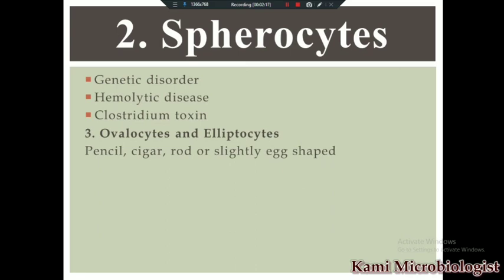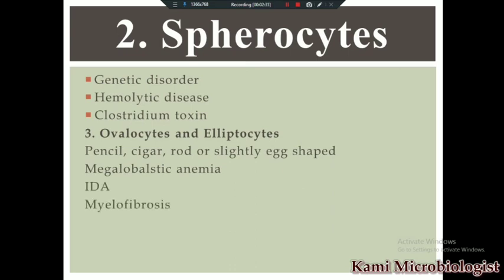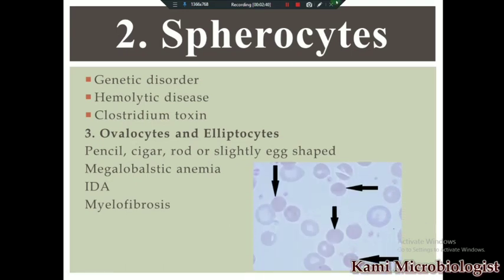Then we have ovalocytes and elliptocytes. Ovalocytes are RBCs that are oval in shape, while elliptocytes are RBCs that are pencil, cigar, or rod-like in shape. Ovalocytes and elliptocytes occur in conditions such as megaloblastic anemia, iron deficiency anemia, and myelofibrosis.